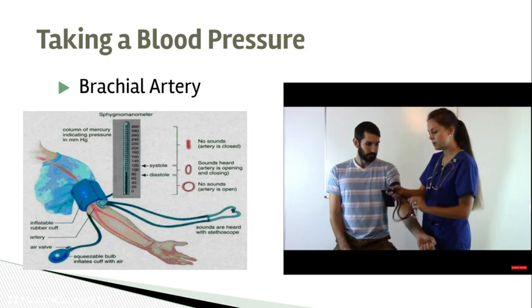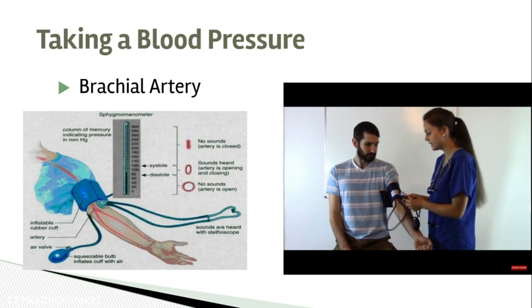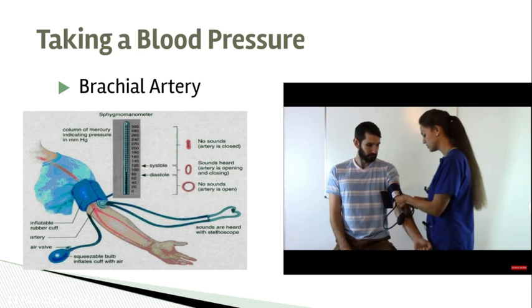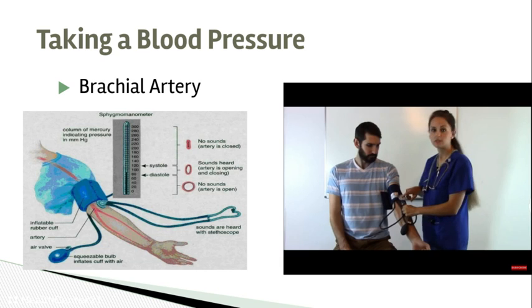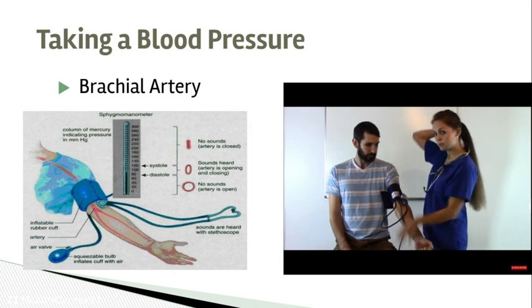So we have that. Now what we're going to do is we're going to get our sphygmomanometer, and we're going to just clip it here. You can do whatever you want with it as long as you can see it, because this is going to tell us everything that we need to know for his blood pressure.